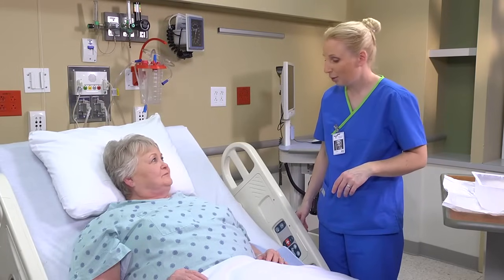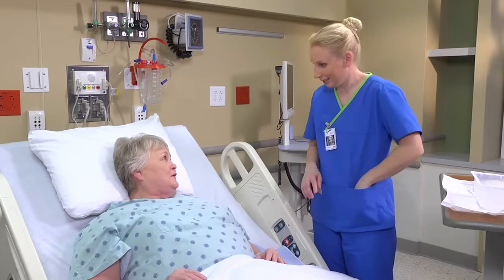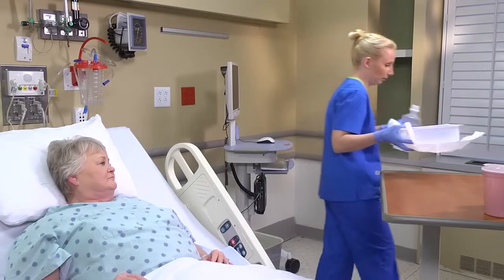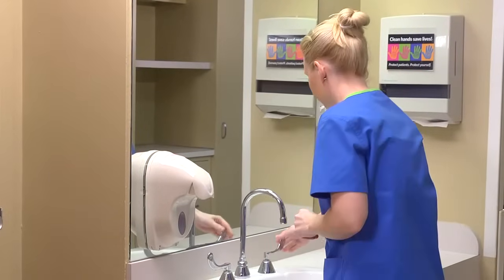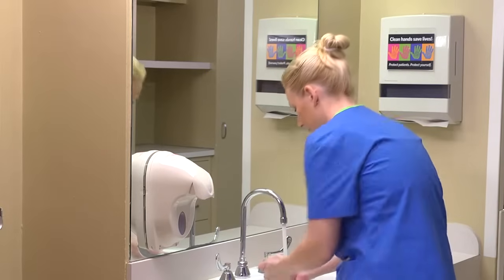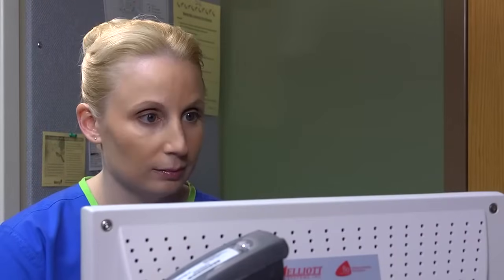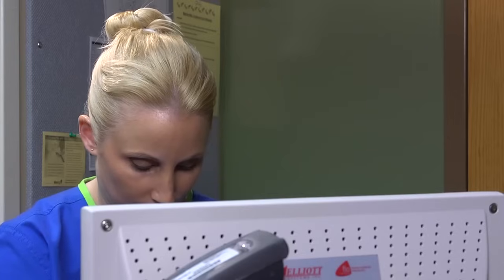Can I get you anything else right now? I'm fine. If you do need anything, go ahead and push the call light and we'll come back. Put on clean gloves and dispose of your contaminated supplies. Remove your gloves and perform hand hygiene. Document irrigation method, amount and type of irrigation solution, characteristics and amount of output, and how well the patient tolerated the procedure.